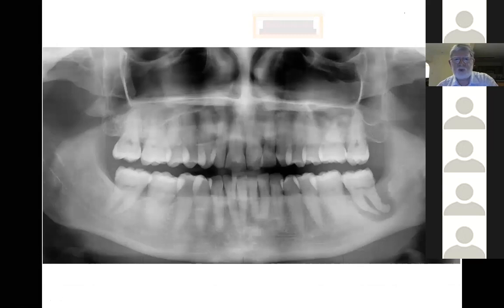Okay, so you'll see something like this. The patient says, please, can you help me? I've got pain. This tooth of mine is really sore. You have a look at the tooth, you smile to yourself and you say, nurse, please can you give me some gauze? I want to take a tooth out. But be very careful, please. I've come across this situation once before.